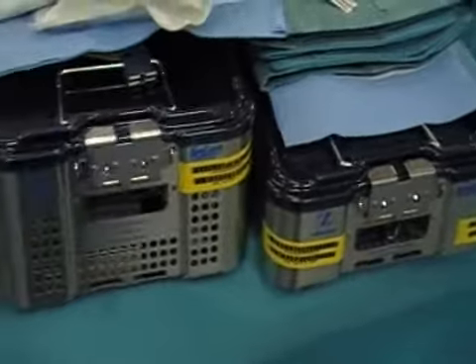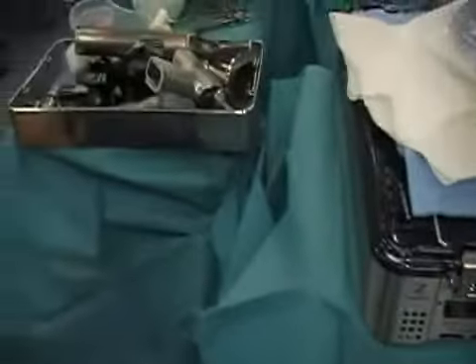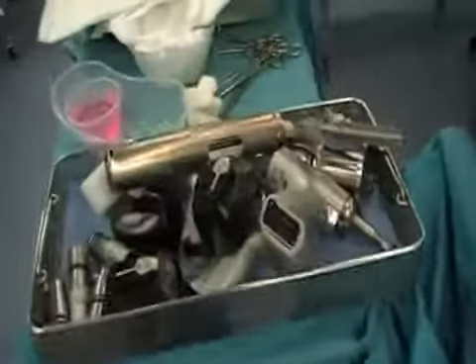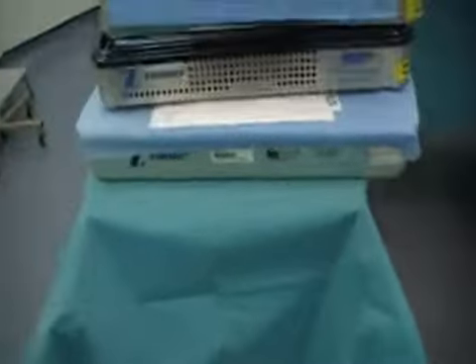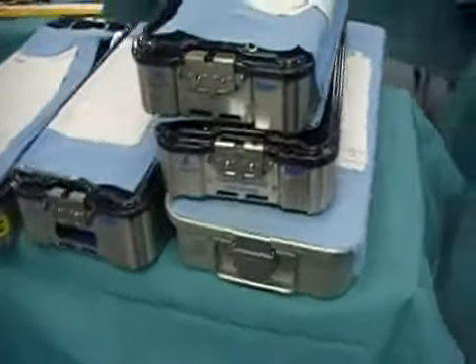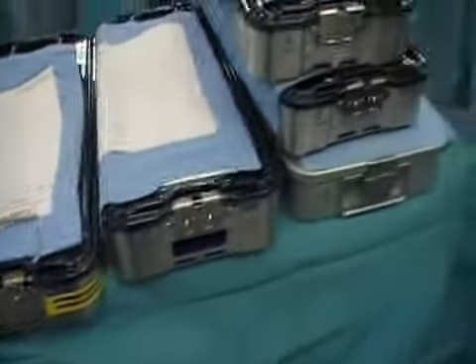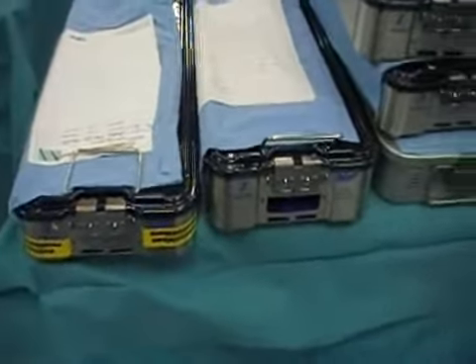As you can see, there is a large number of trays and instrumentation which is used for standard knee replacement. This can be cut considerably with the PSI system, because with patient specific jigs you don't need all the manual instrumentation, and that will decrease the cost of sterilization and also decrease the turnover time.